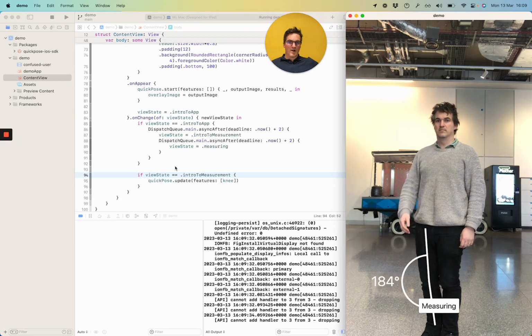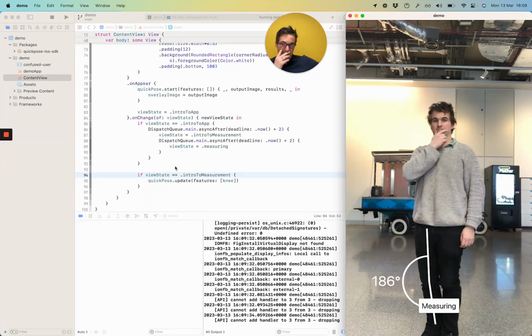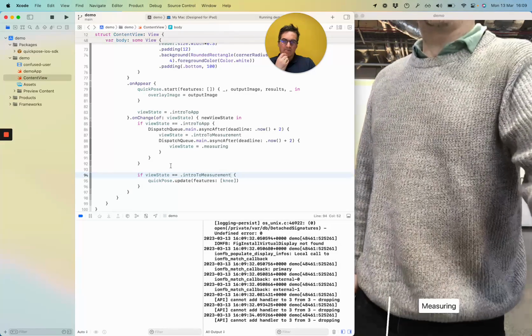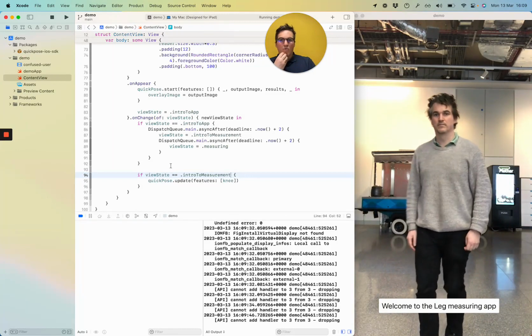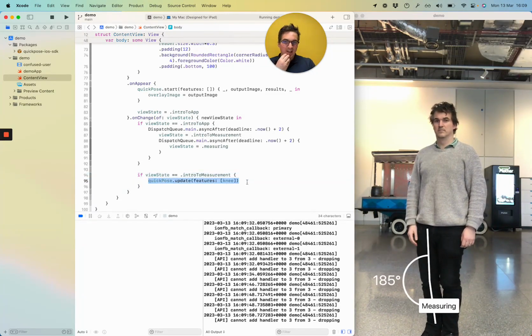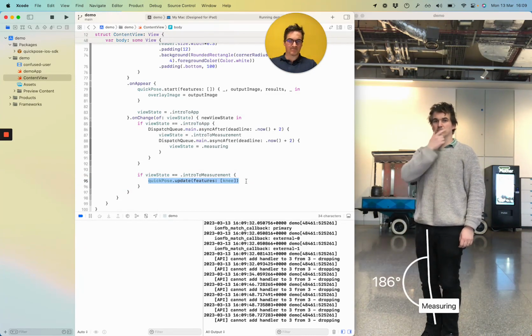Okay, I might actually change my point of view on that. It felt quite busy going into that. So how can we do this? What I think would be good is if it's only after a delay that it shows.